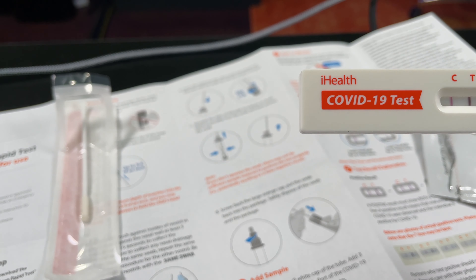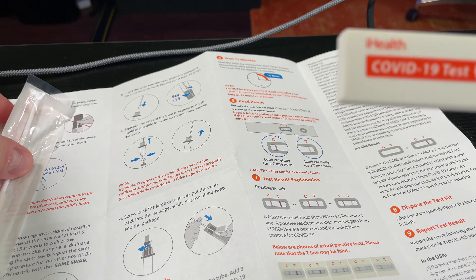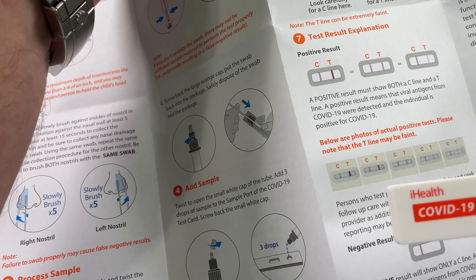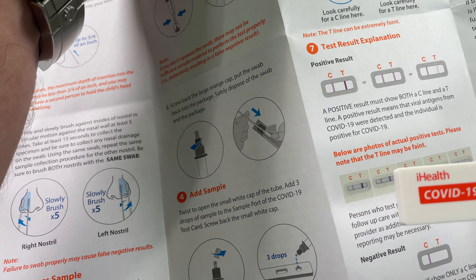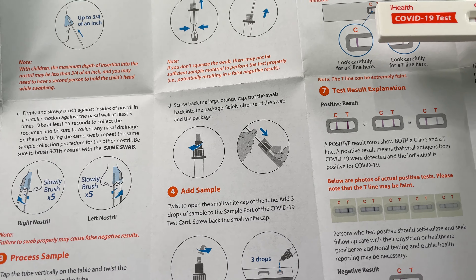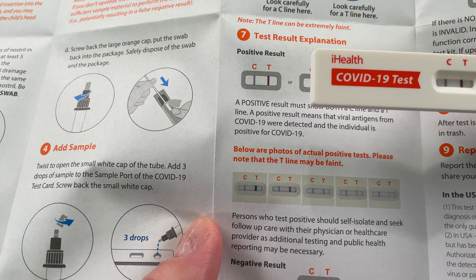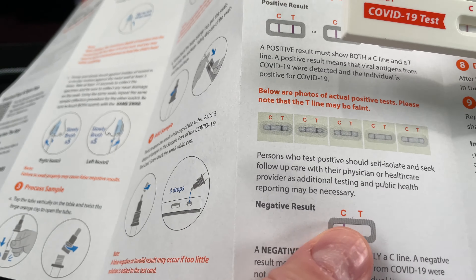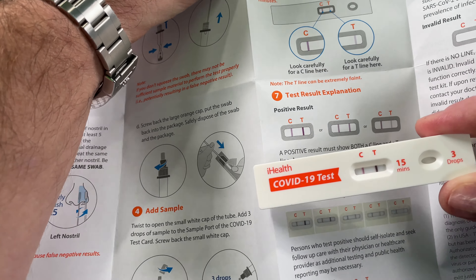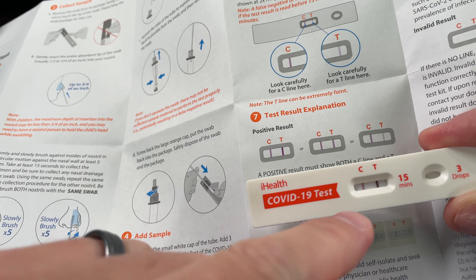Okay, let's look at the results. It says test explanation — below are positive test lower photos of actual positive tests. Please note the T line may be faint. A negative result... okay, so here we go. Positive result right here — it says C and T both have a line. I got a Charlie and a Tango. I got a Charlie and a Tango there.